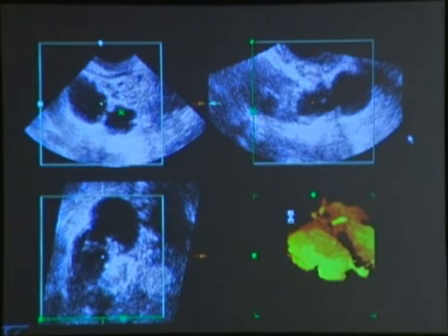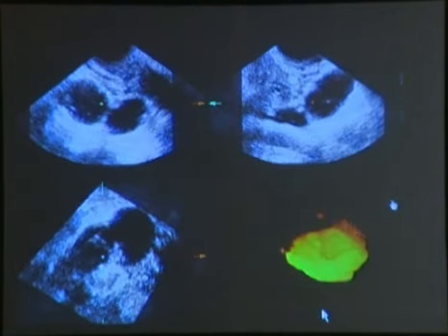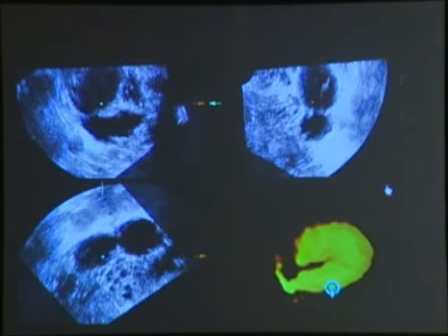nature of this is, and Beryl showed you a case of this, even though it was not obstetrics, Beryl, that was GYN. And then you move it around a little bit, and you see very soon, that's the sculpting tools. You cut off whatever you don't, you clearly see that doesn't belong to it. The colorization is different. You cut off that one too, and you already start to see what I mean. This will be a hydrosalpinx.